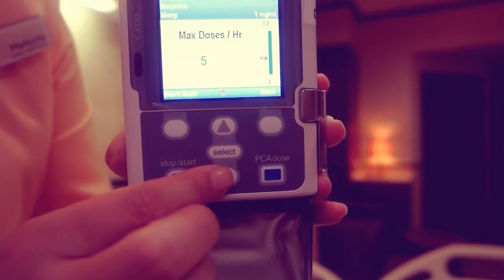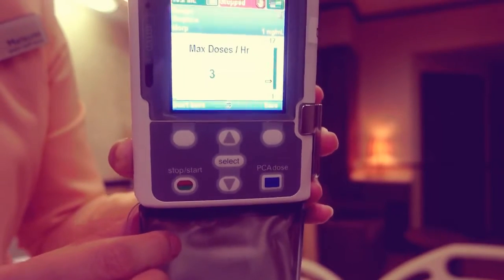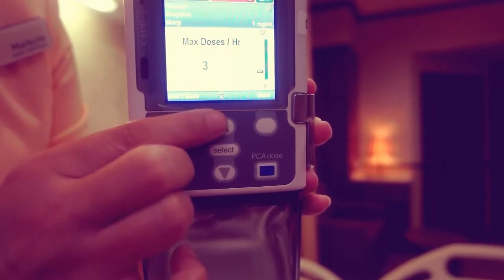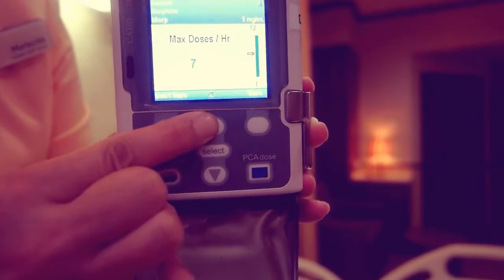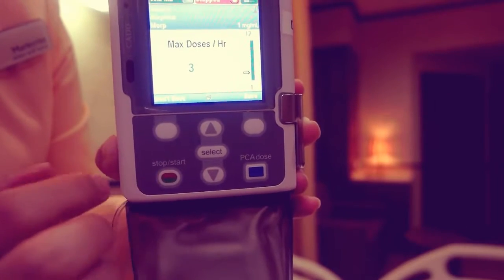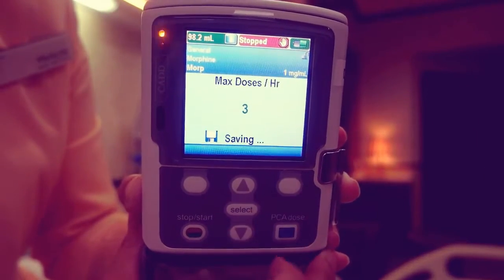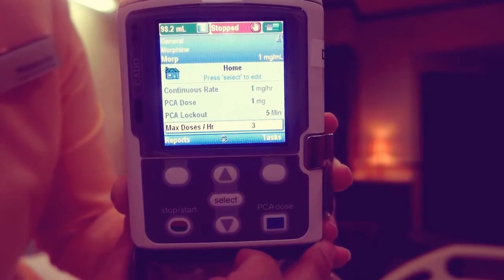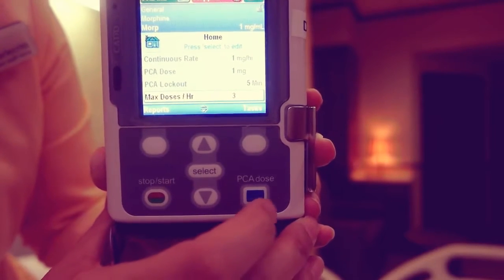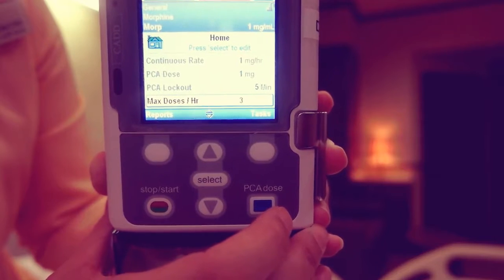Scroll up or down to the new value, then press save. Repeat the steps for each patient's specific parameter that you want to change.